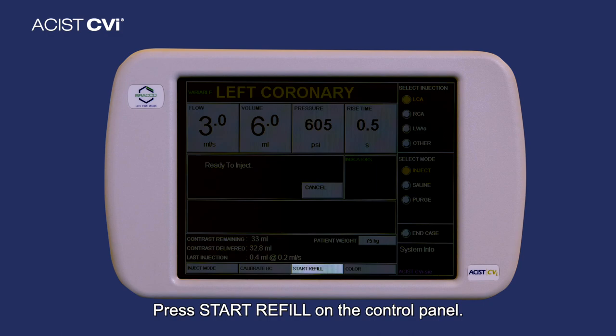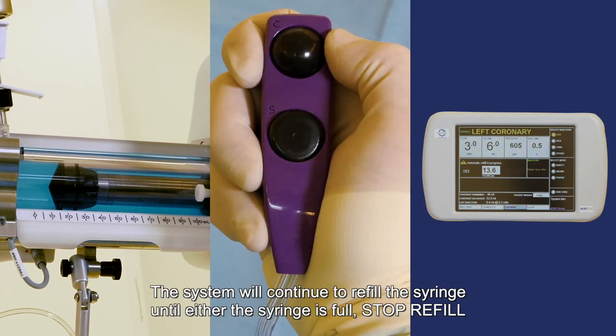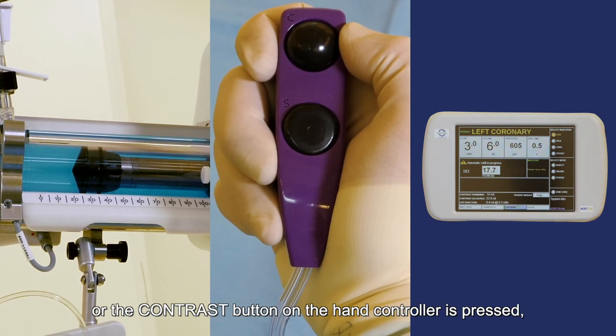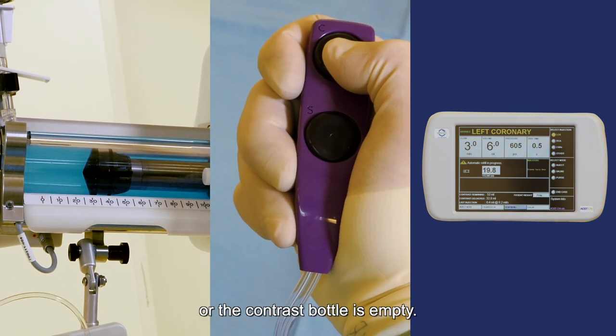Press Start Refill on the control panel. The system will continue to refill the syringe until either the syringe is full, Stop Refill or the contrast button on the hand controller is pressed, or the contrast bottle is empty.